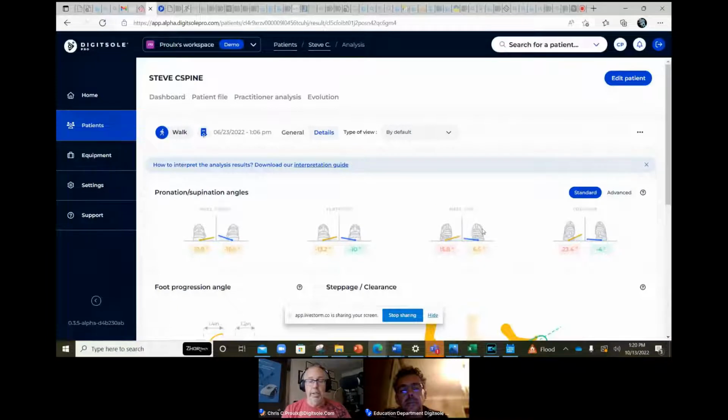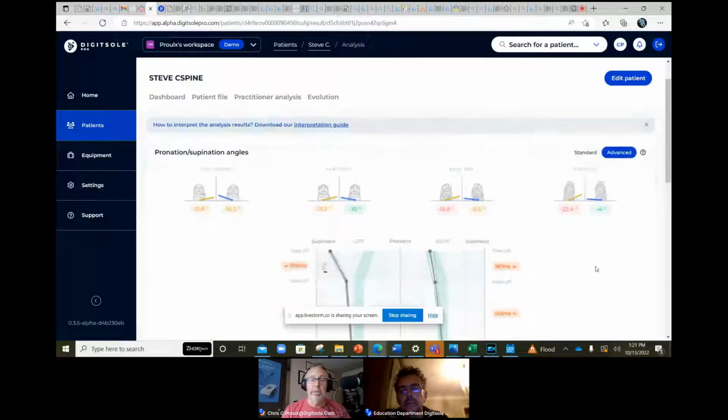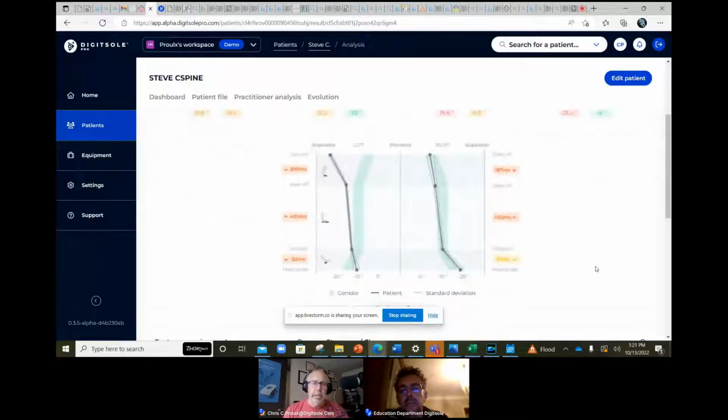And again, we continue the normal pattern on the heel lift on that right side, but he's further increasing that inverted angle on that left foot. And then we see over here on toe off, that right foot, again, is following a normal pattern, but the left foot, he's going into even more of that heel inversion position.